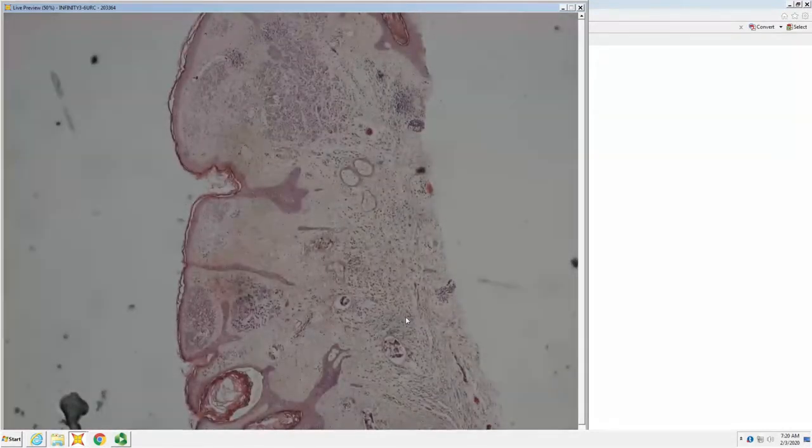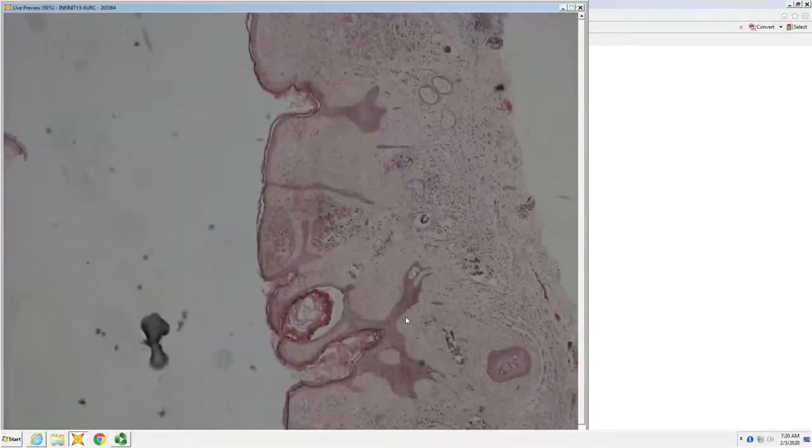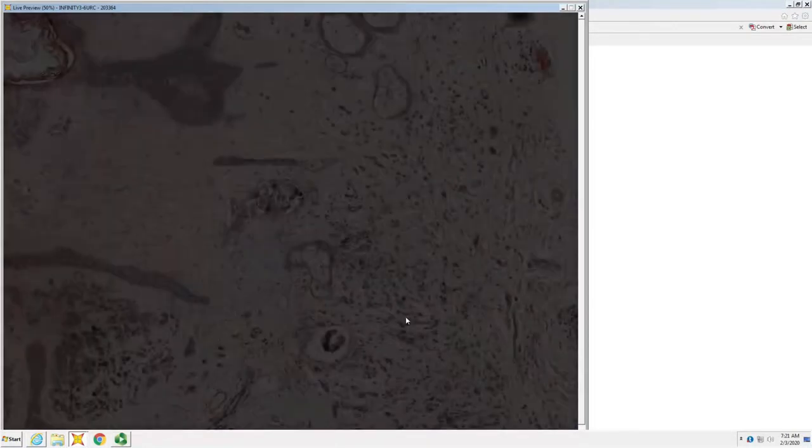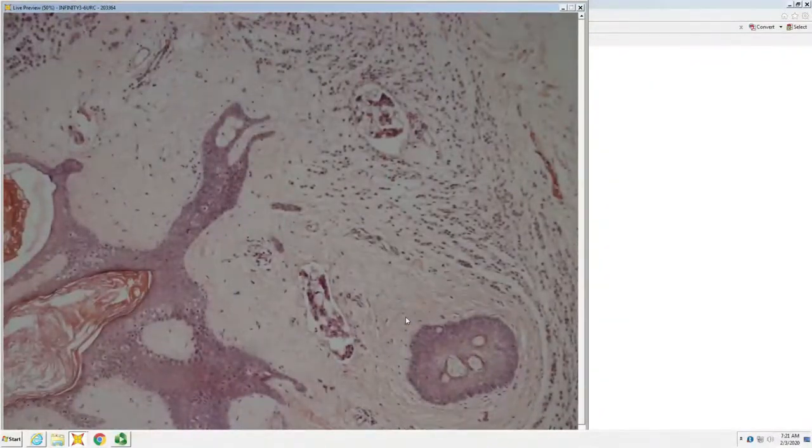And that's if you don't have more characteristic changes. This one was a nevus removed to remove a bothersome nevus and happens to be full of breast metastasis. So, you know, you will have incidental identification of metastatic carcinoma as well.